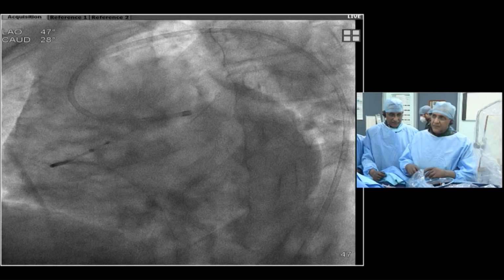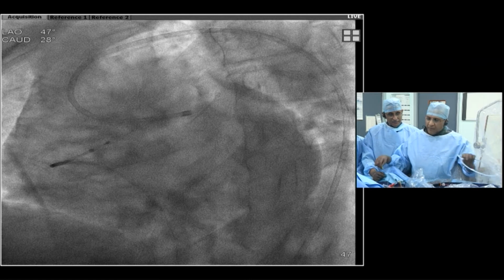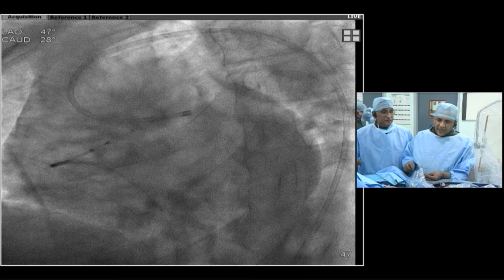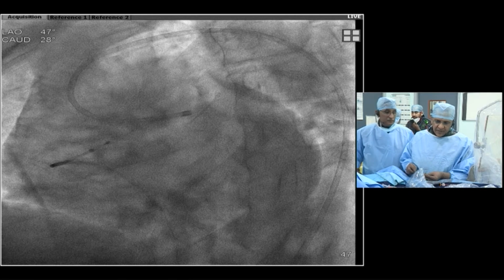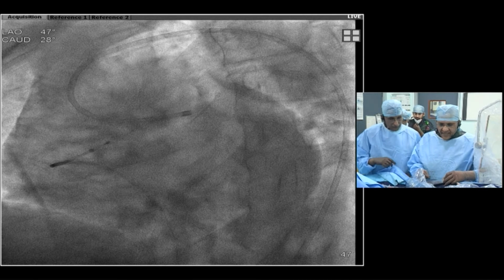Thank you, Ajit. Thank you so much to all you guys over there. I think the 2 points that I wanted to make are, we need to target the lesions that we are going to do before and then stick to a plan, not deviate from a plan. And sometimes metal jacketing these arteries and going into distal arteries may not be worth it unless they are critical lesions. So I think those 2 are important points for me. And IVUS makes our life easy because it really reduces the contrast that we use and takes away the pressure of having to be in the right ballpark with size and length.